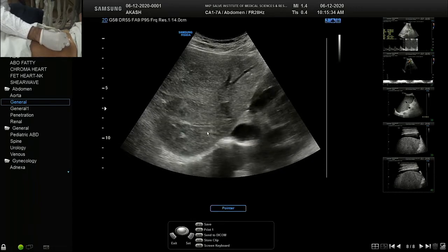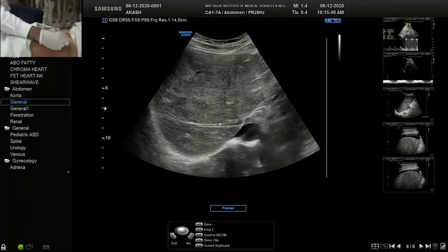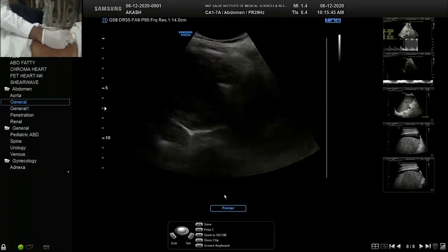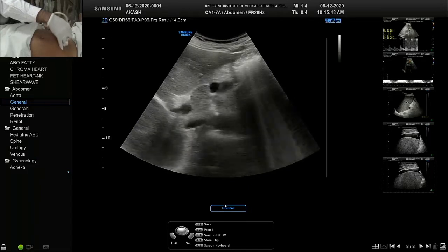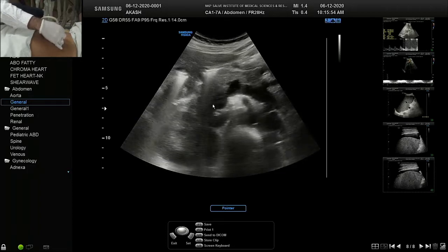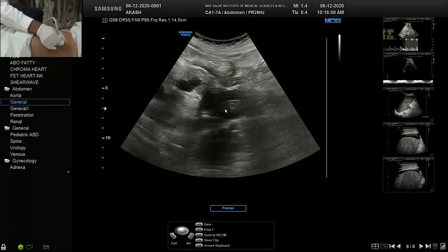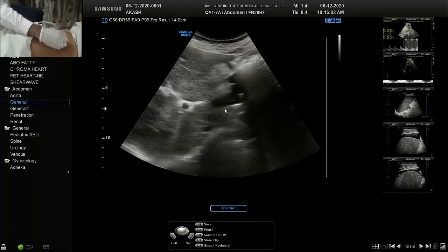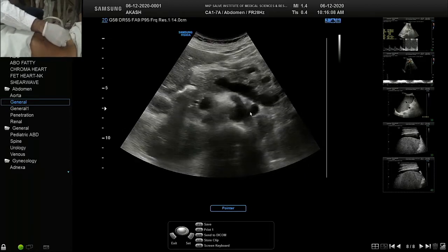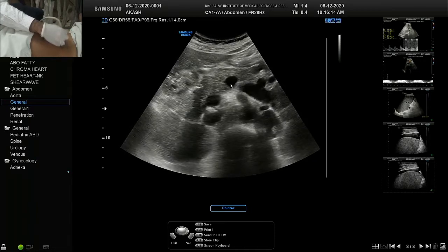Those are hepatic veins, not very prominently seen, but yes, that is right. And that is the left one. We will see at confluence, we are able to see the portal vein. We are seeing this confluence. SMV is seen, all are prominent. And while seeing the confluence, what we saw is something coming here. That is splenic vein, that is confluence, and something is coming here.